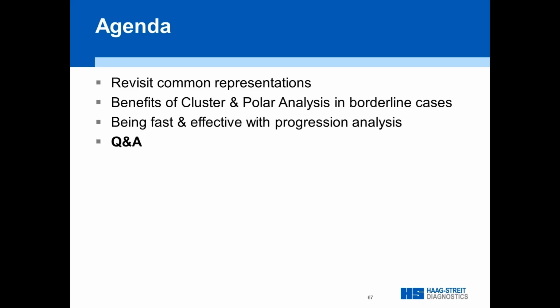Well, there's debate on this, and I would say half of the world is using the top and half of the world is using the dynamic strategy for all their patients. When we look at science, basically it boils down to this. When we do pure mathematical modeling, the dynamic is a bit more accurate, and the top kind of misses local subtle defects. But the top is much easier for patients, not only because it's shorter, but also because it starts very superficial, so it's kind of reinforcing the learning of what patients are supposed to do.